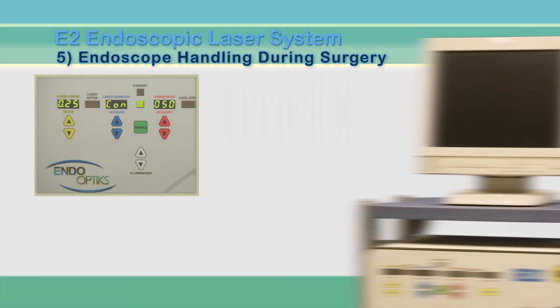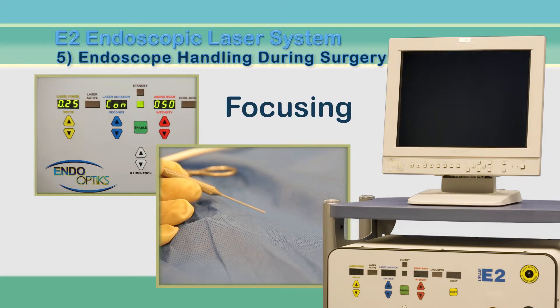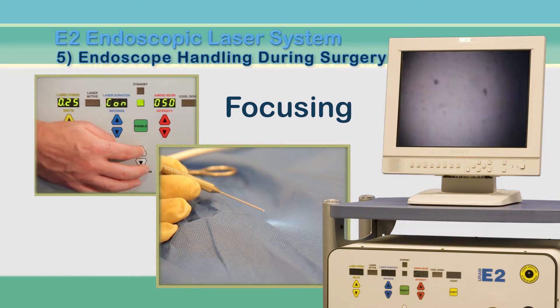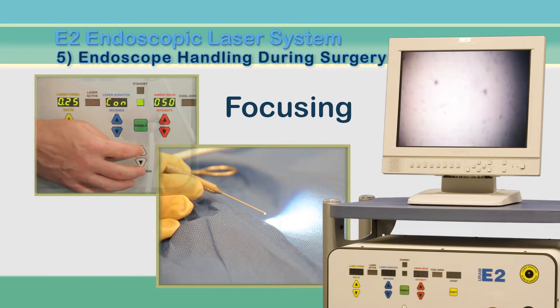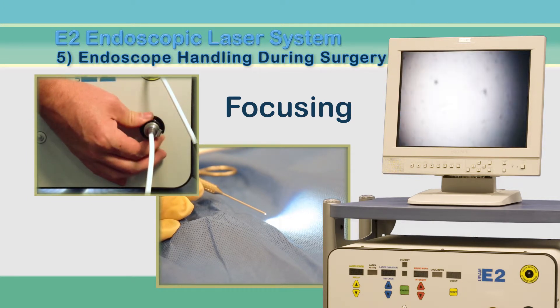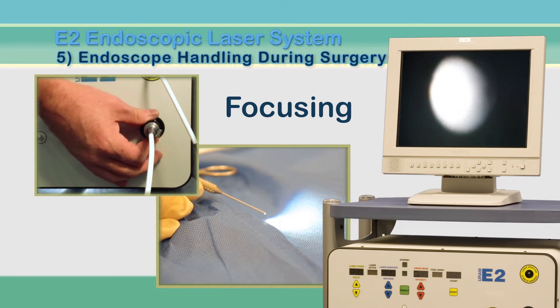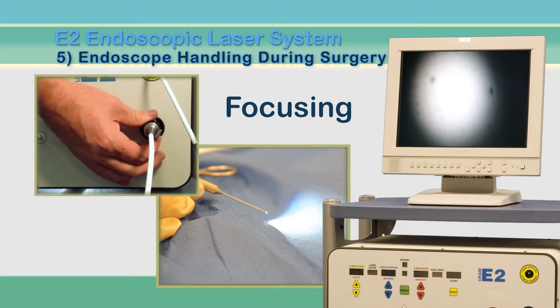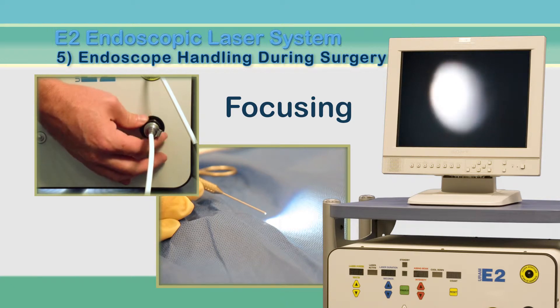Now you're ready to focus the image. With the handpiece placed securely on the sterile drape, aim the tip at a piece of cloth. Begin by pressing and holding the up arrow to increase the illumination. You will see light from the tip of the endoscope and on the monitor's image circle. Bring the image into focus by rotating the focus ring on the video coupler. If the white circle on the screen is getting smaller, keep turning until the image is in focus. If the circle is disappearing, turn the ring in the opposite direction until an image begins to appear.